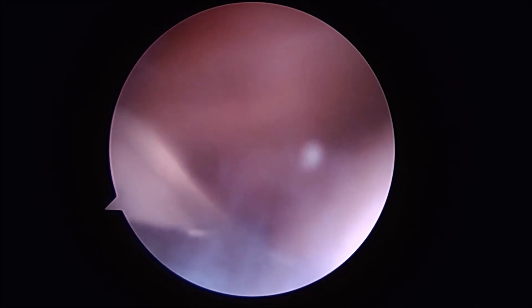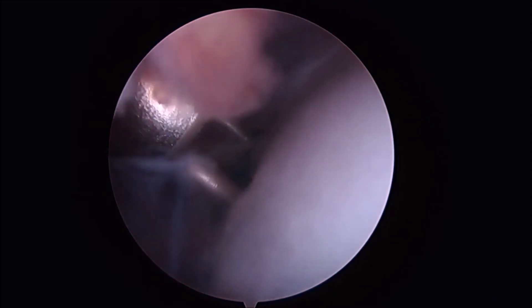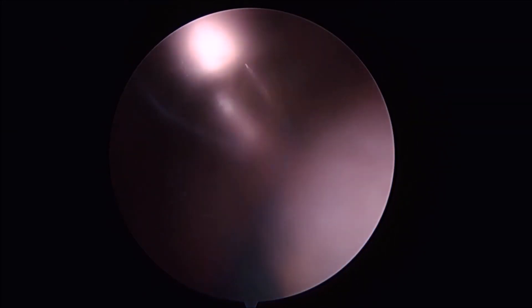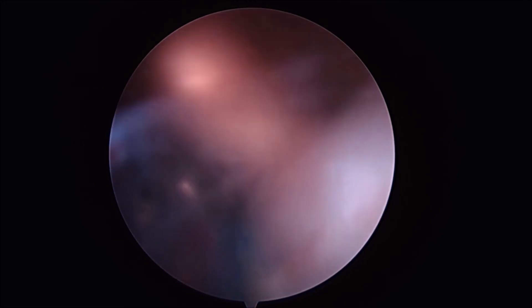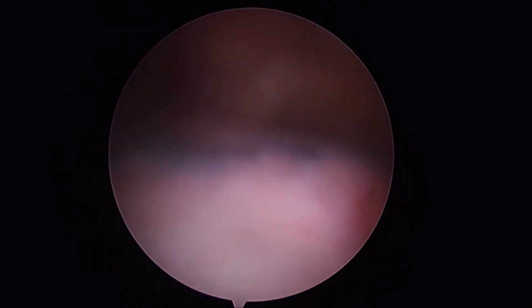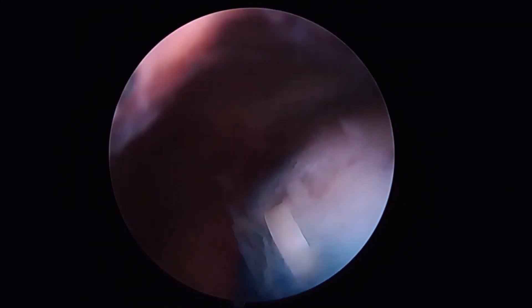Our lateral pins can then be placed into the rotator cuff to allow for smooth delivery of our peak staples. Typically two peak staples are all that are needed along the lateral footprint. Once this is complete we then take the shoulder to a full range of motion to ensure adequate fixation as well as no further impingement.